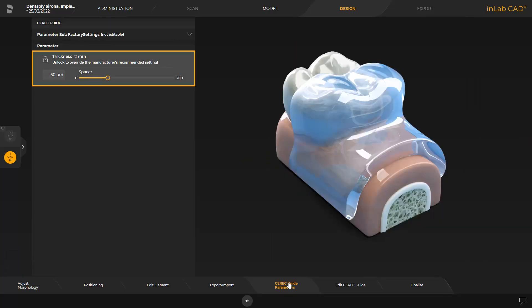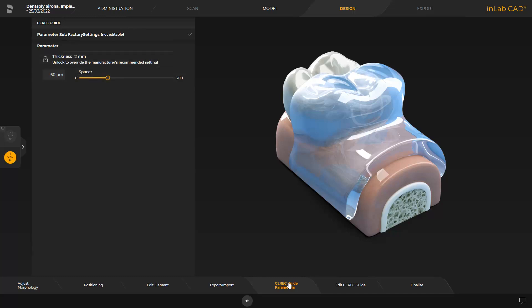There are two parameters that can be adjusted individually. The thickness parameter is marked with a lock, indicating that the 2 millimeters are a manufacturer recommendation, but it can be modified at your own risk. A thicker guide will be stiffer and less flexible. Adjusting the spacer determines how tightly the guide will be sitting in the patient's mouth. A reduction of the spacer leads to a tighter seat of the guide. By raising the spacer, it will be easier to place and remove the guide. In our case, we skip all adjustments and go to the Edit CEREC guide step.